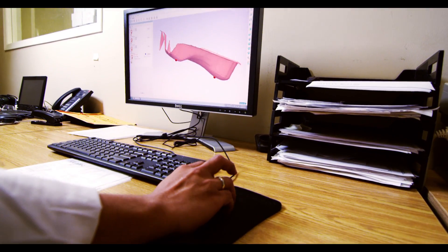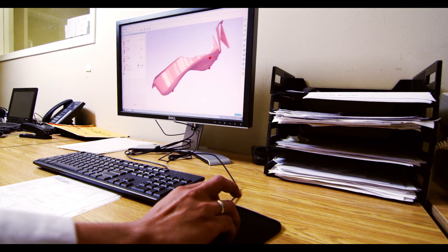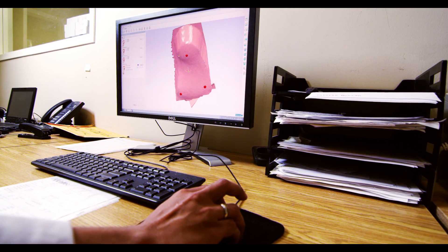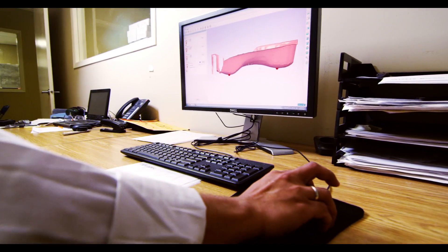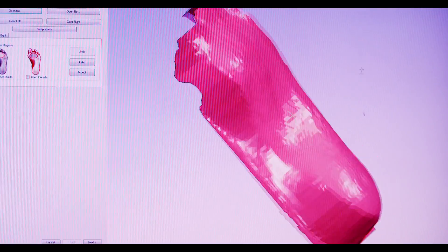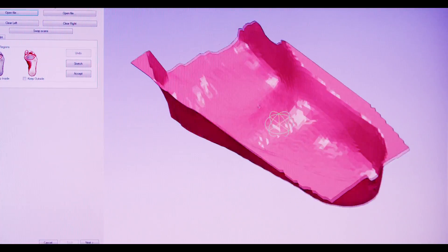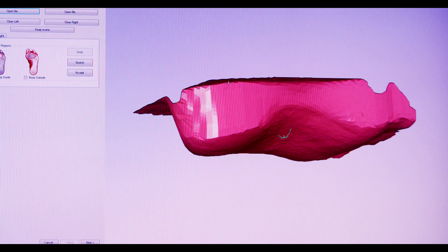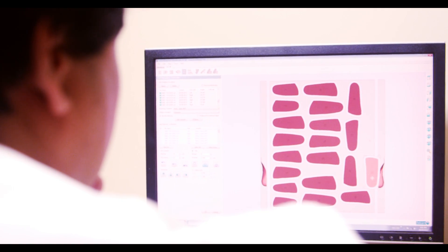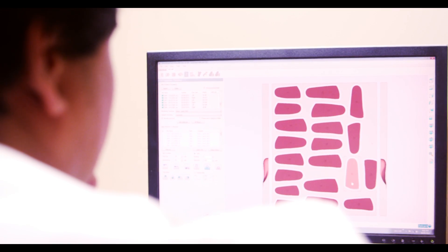Next, the 3D digital image is modified and manipulated by one of our lab experts to create a smooth, comfortable shape that will hold your foot in the right position for the best possible function. We use the most advanced CAD CAM software available to do this processing and can handle almost any foot type and support requirement. This system allows us to replicate a previous order perfectly at any time in the future.